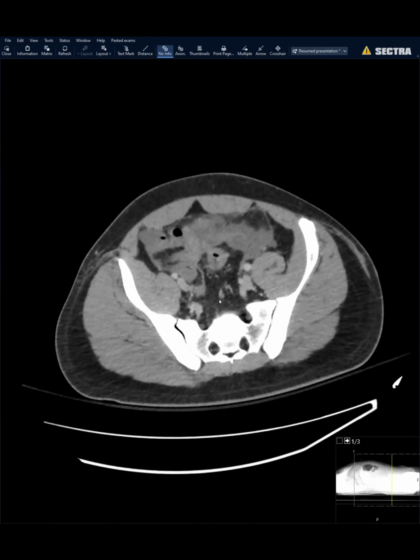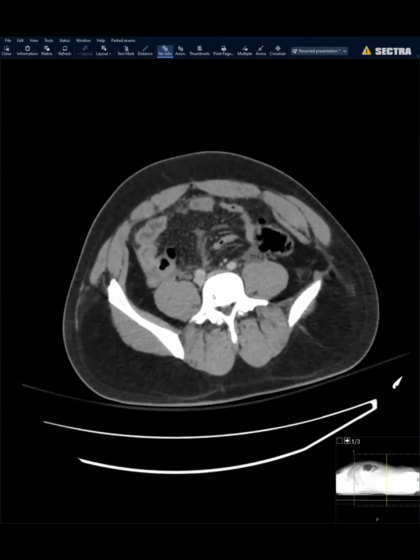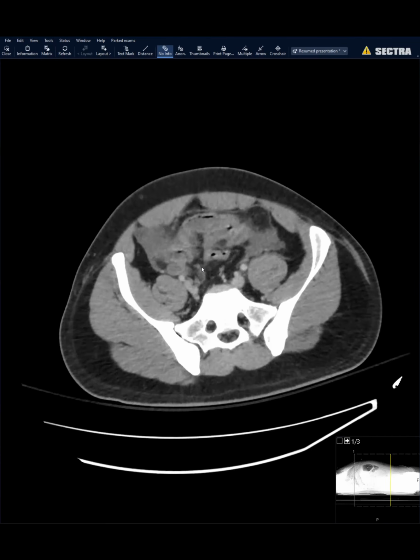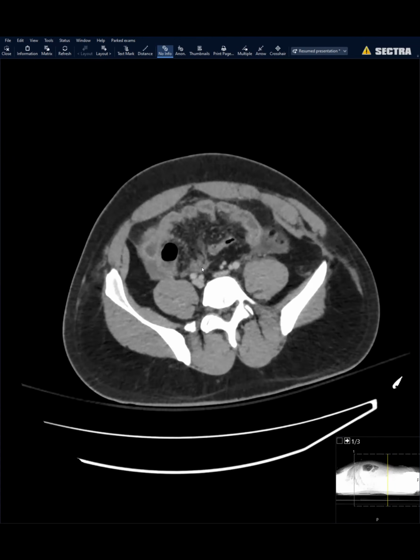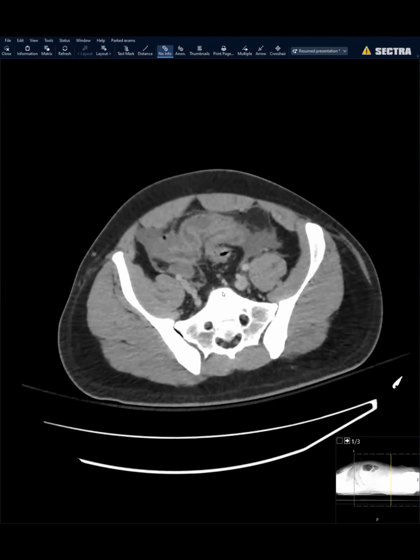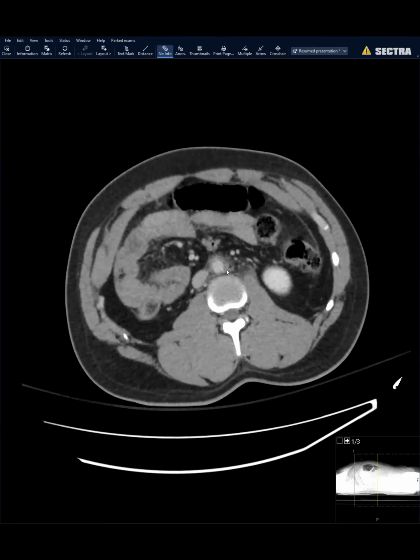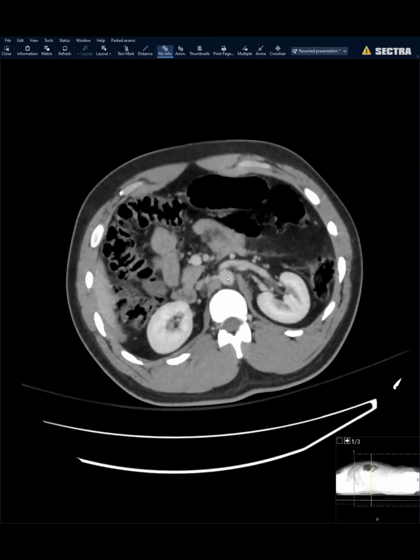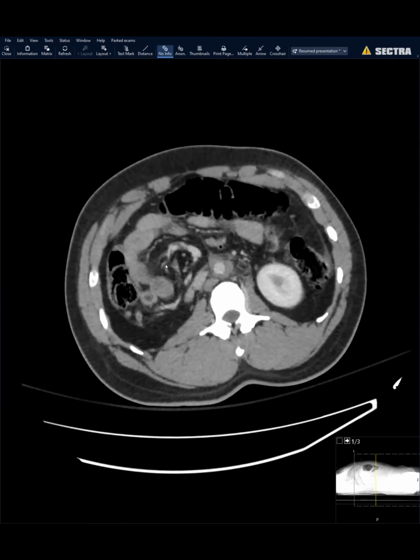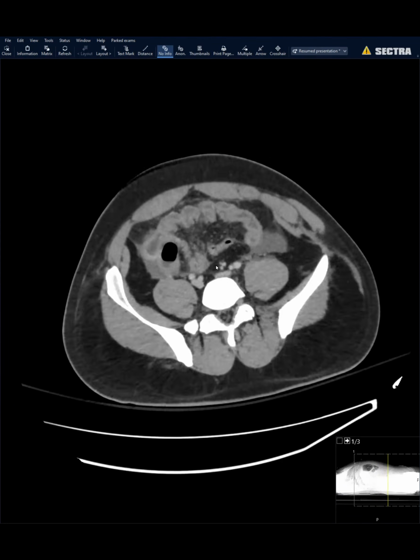So to cut a long story short, this patient did go to the OR and was found to have about 1.2 meters of devitalized ileum from trauma from a mesenteric hemorrhage in the pelvis. I think that's the teaching point here. They didn't really look at the aorta, so we don't have any follow-up on how they're treating the aortic injury or periaortic hematoma that they're seeing here. Probably just follow-up, I guess. But the teaching point was to pick up punctate air and to look for devitalized bowel in trauma patients.